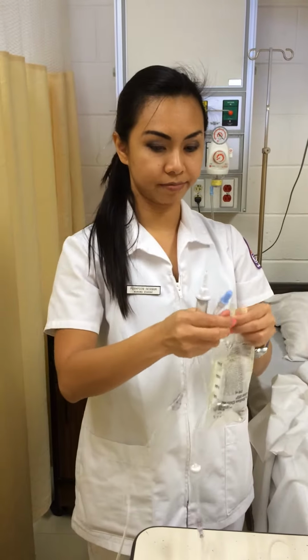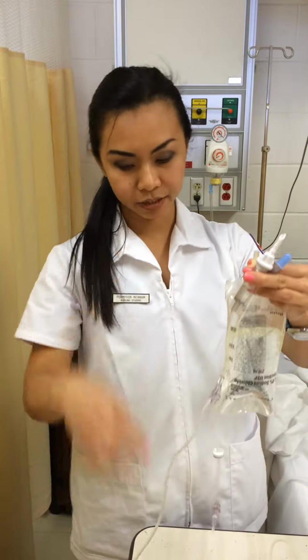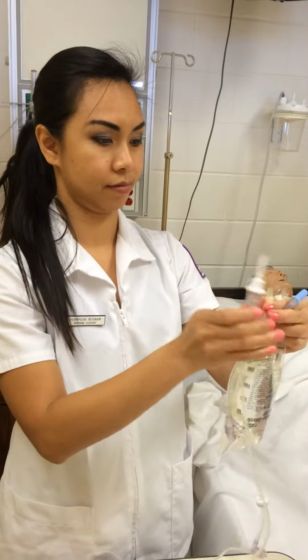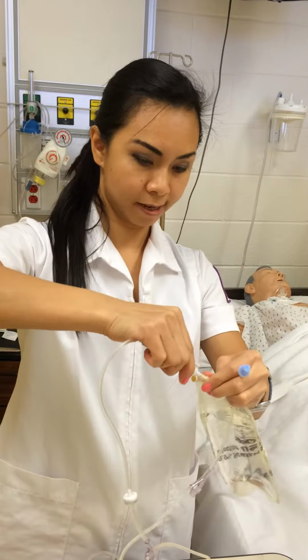So I open it. Before I attach it, I make sure the tube is clamped. Spike into the IV bag.